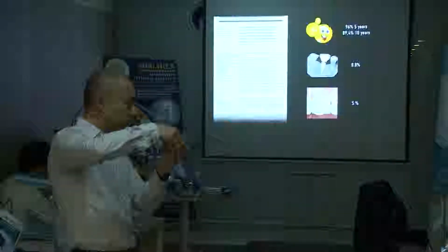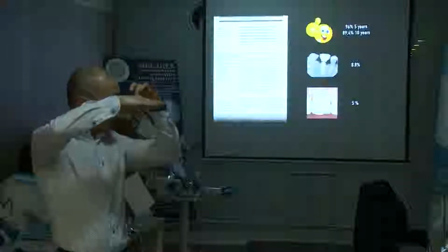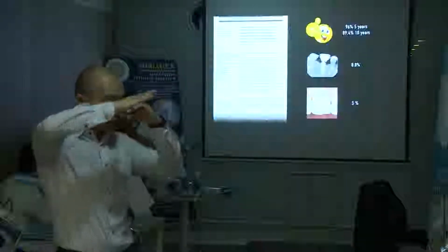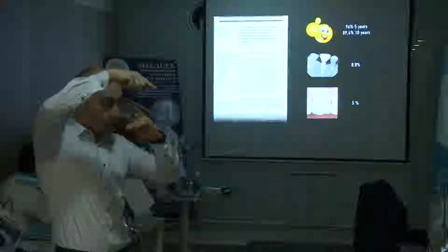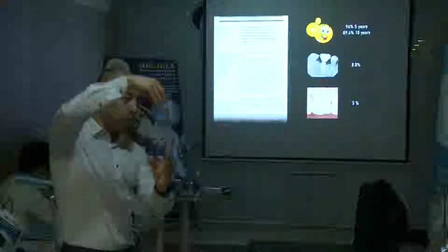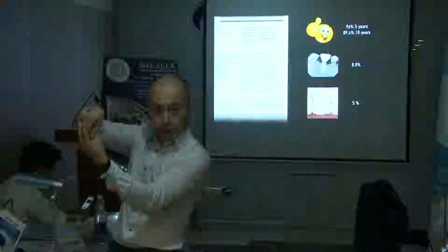Why do we have screw loosening? It's because we have the crown on top of the implant fixated by a screw. But when you're chewing, this happens. And by millions of times of chewing, the screw goes out. But when they're inside each other, and when you're chewing here, this goes together as one.